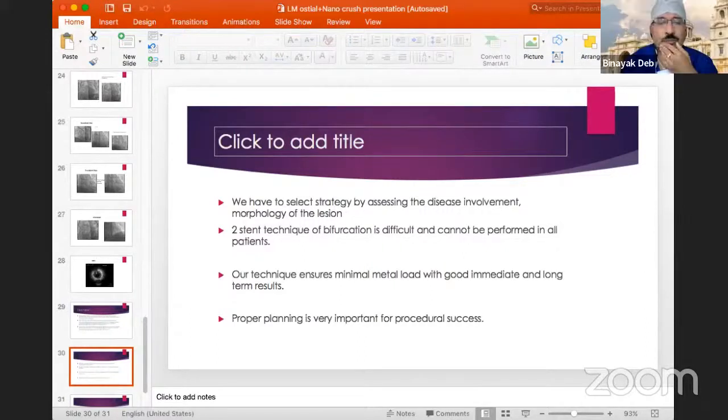Yeah, Dr. Ghosh. The thought on the second case, it was a hemodynamically unstable patient, as you said, with impending failure. Before you take on such a procedure, if you have the provision, you should have an anesthetic standby who would help you intubate the patient very fast should it be necessary. The other thing, you would also think of intra-aortic balloon pump support. At least keep it handy if that is required. These are things you need to pre-plan before you take on a much higher risk procedure.